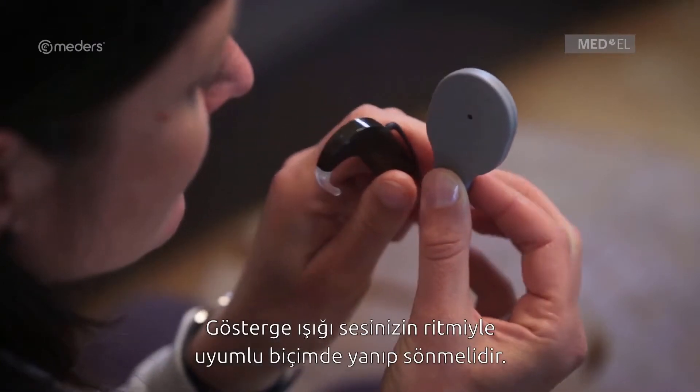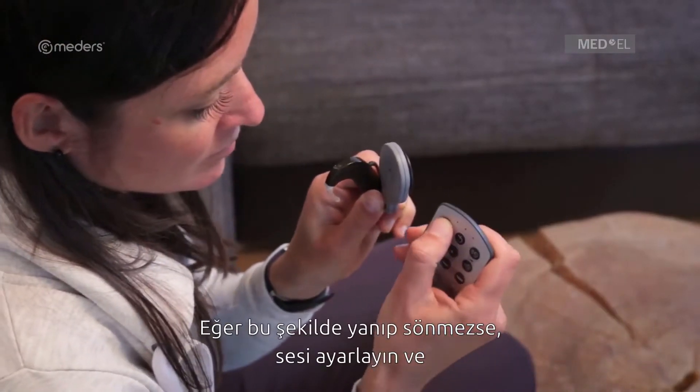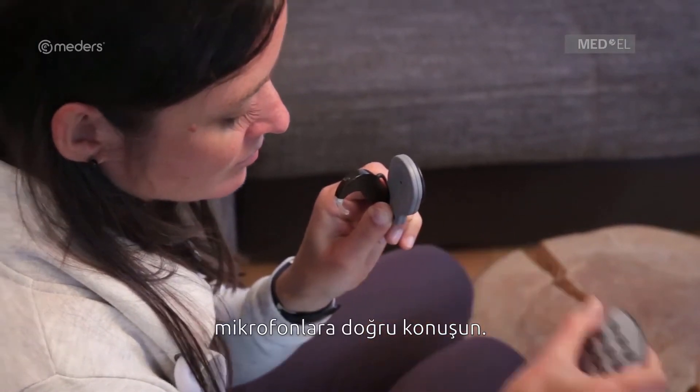The indicator light should flicker to the rhythm of your voice. If it doesn't, adjust the volume and speak into the microphones.